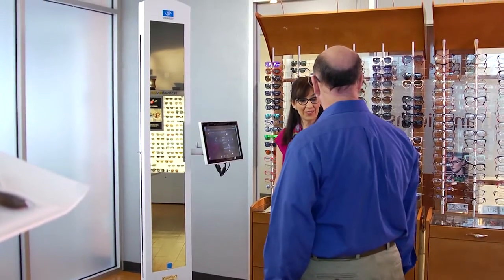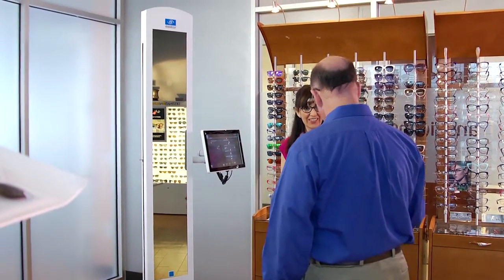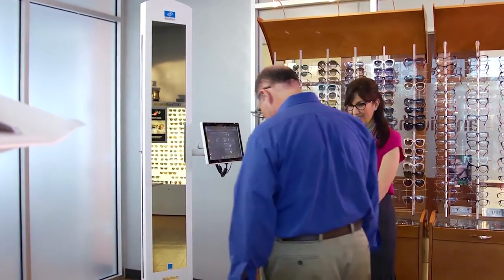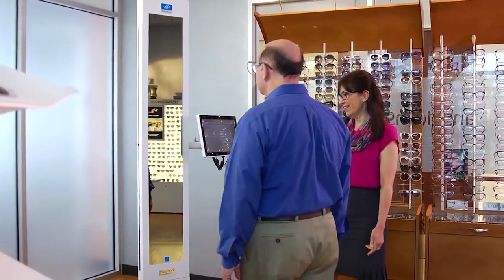To take the head-eye ratio measurement, position the patient about two feet from the mirror. Then select the dynamic head-eye ratio icon on the measurement screen.